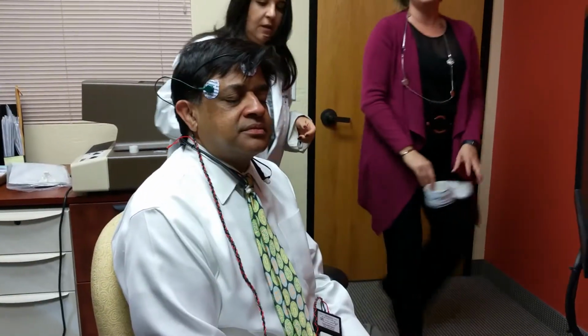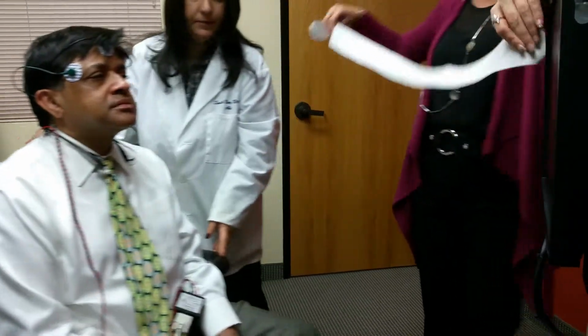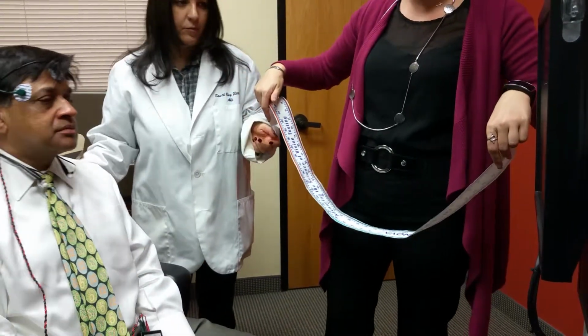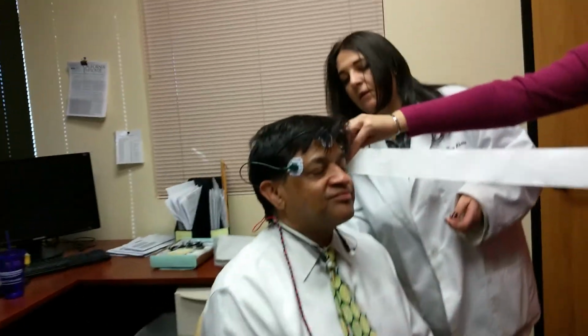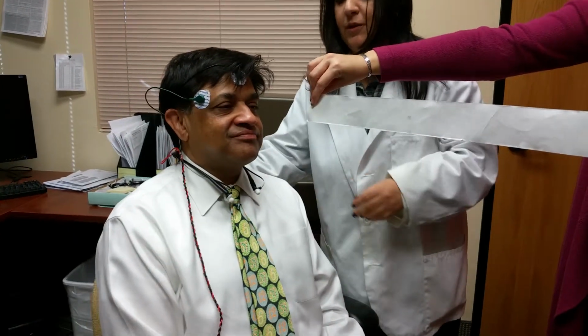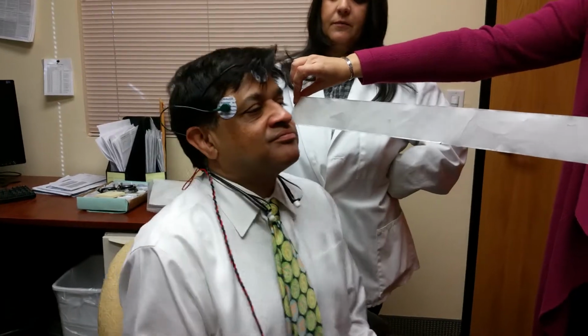Right, but whenever we're... there's the ruler. Are you looking for the ruler? It's the edges, like I was explaining to them earlier, it's the edges between the checkerboard patterns that's stimulating. Okay. Are you nice and centered with the computer monitor? Do you need to scoot over a little bit? Open your eyes now. Back a little bit, little back. No, the chair. Yeah, a little more close. Okay, good now.